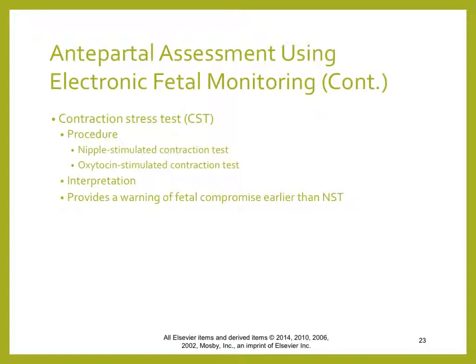These contraction stress tests, or CSTs, provide earlier warning of fetal compromise than the NST. It actually has fewer false positives. The reason they do not do these all the time is because we're giving mom oxytocin. They are expensive. They are considered invasive. And they cannot be performed on women who cannot have a vaginal delivery.